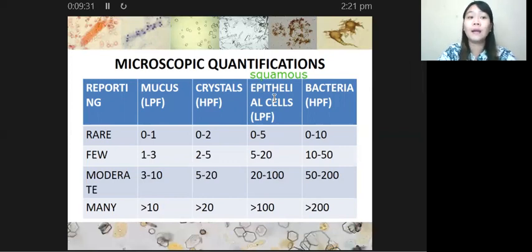That is why, if you go back to the video which we provided to you, Sir Ruben said, we are in LPF. So if we are in LPF, let us count the squamous epithelial cells, because it is LPF. And of course, along with the squamous epithelial cells, after reading them we also count the mucus threads, because they are both LPF.